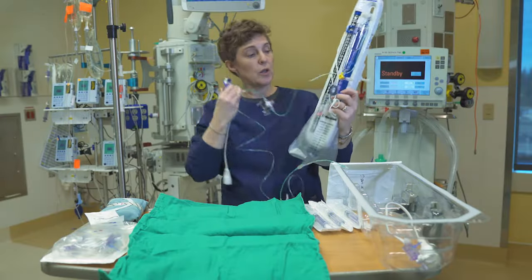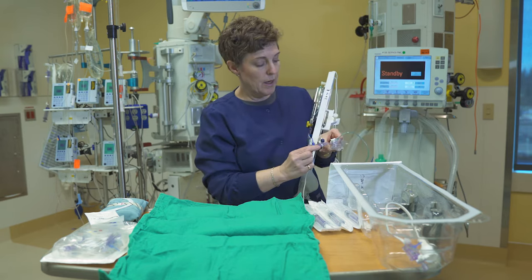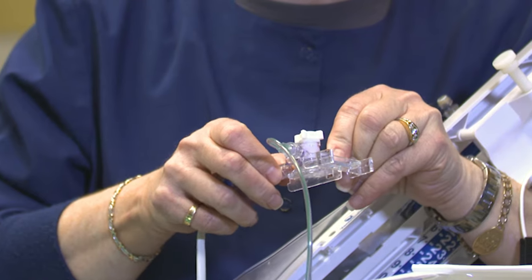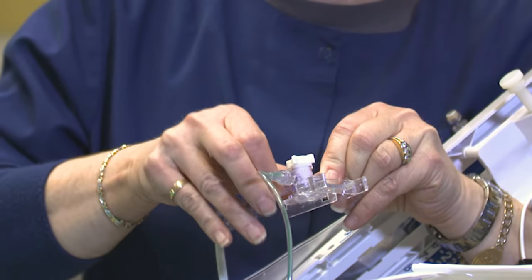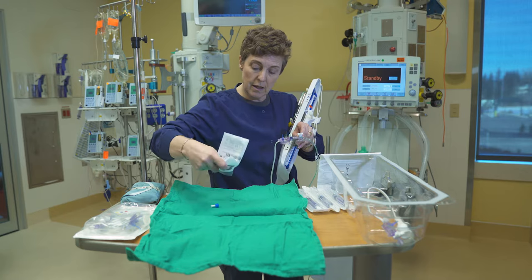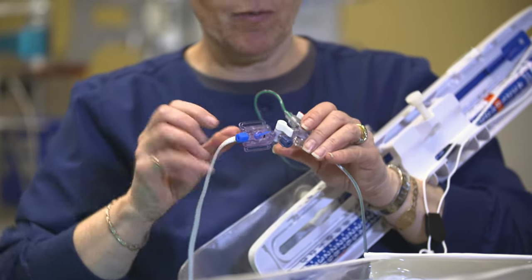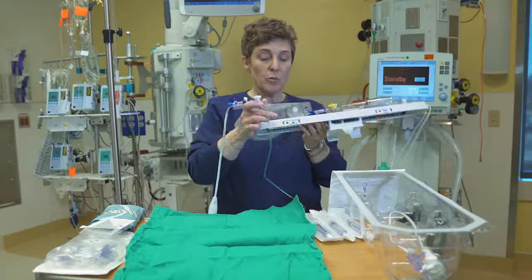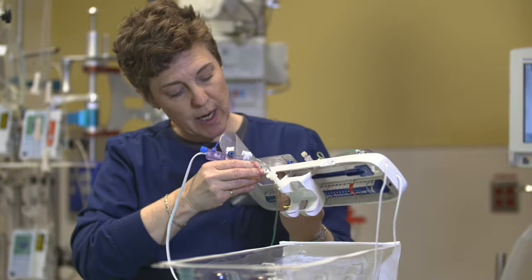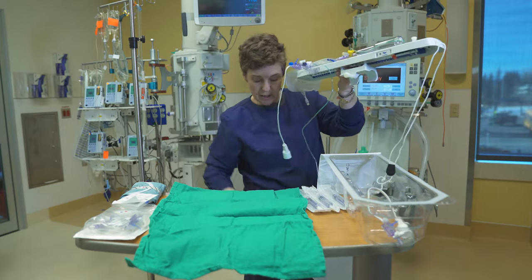The transducer then goes onto my drainage system and attaches to this piece right here. I'm going to attach it now. Then I'm going to use my cap and put it on the other end of the transducer, because we need to keep everything very, very clean. We're going to clamp this piece into the ventricular spot — and it snaps right in. Making sure all my connections are secure.